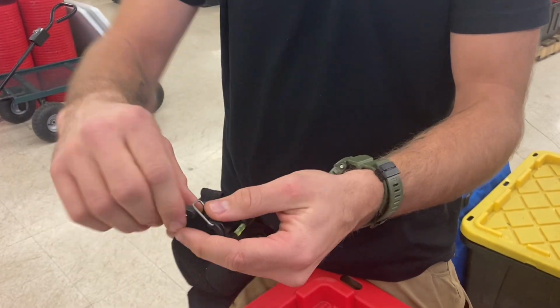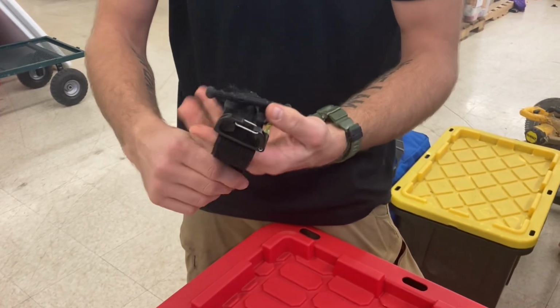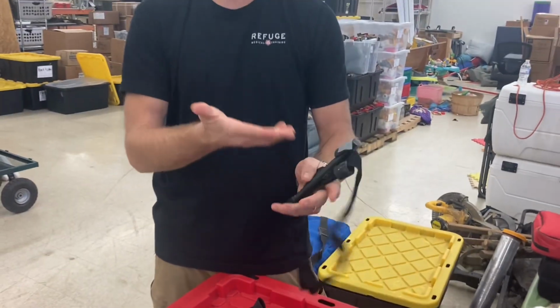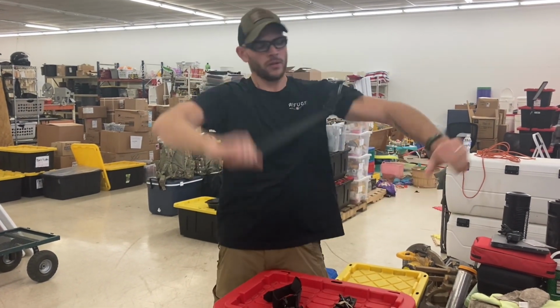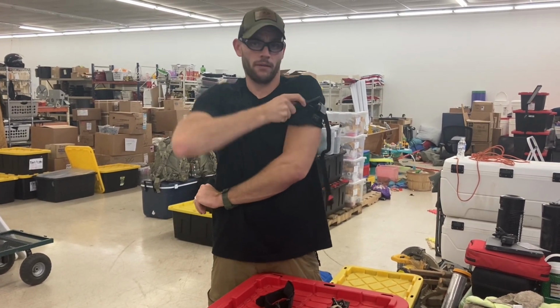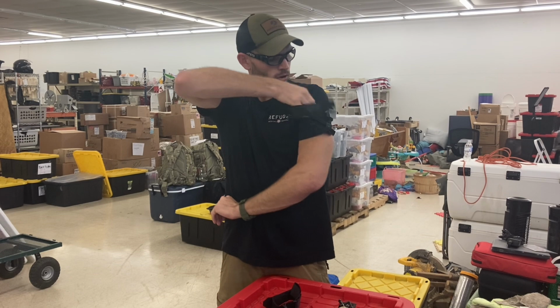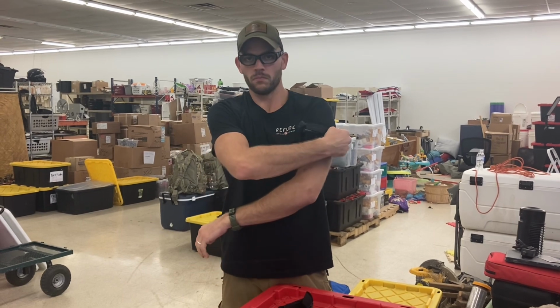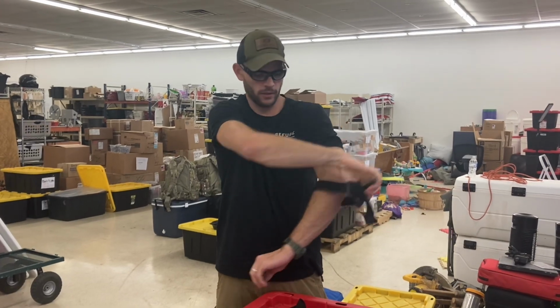Well, that's part of what we saw on the leg in the first video. So we'll put that back. You can see this does not have an extensive amount of wear, okay? Now, if I take a CAT tourniquet and I have it pre-staged so it can fit in a pocket with the windlass vertical, right? I pulled it out of my pocket to do this. Throw it on my arm, cinch it down, pull the strap tight, and quickly, now keeping in mind I practice with this one more, okay? But I can quickly get enough arterial compression. Yep, and it worked as a tourniquet. So that was simple, it's repeatable. I can practice with it.